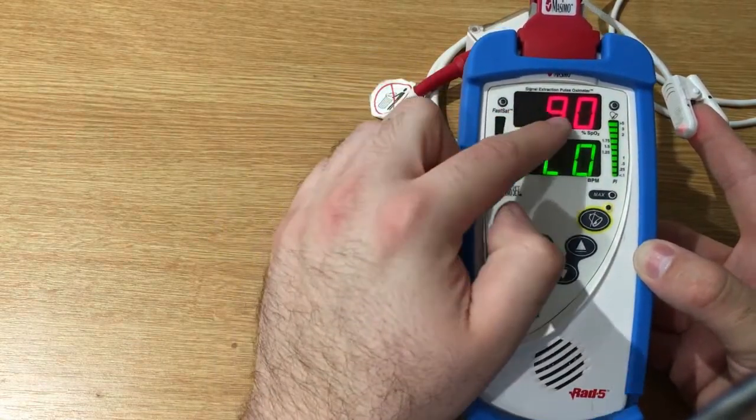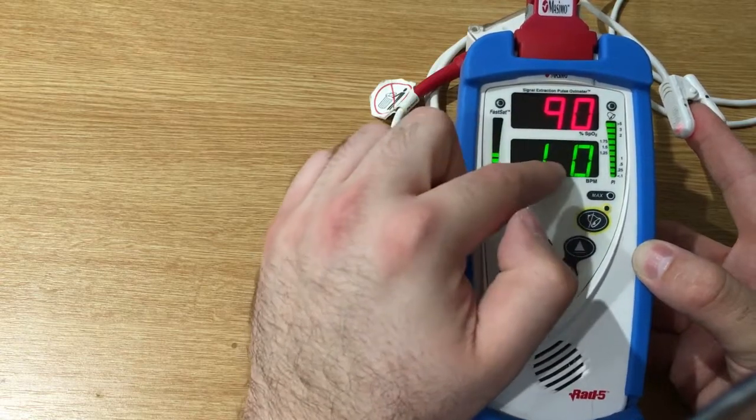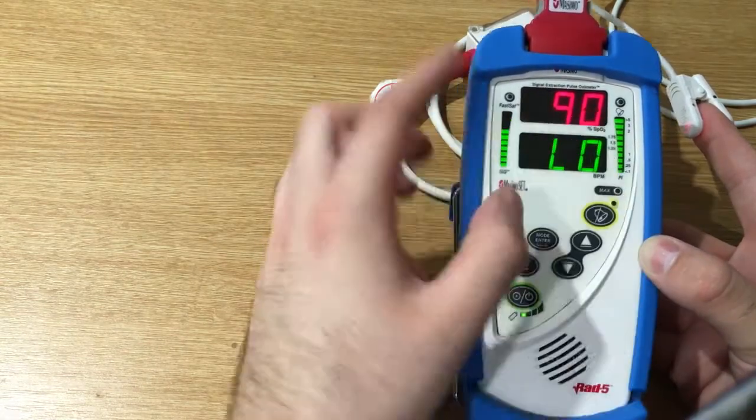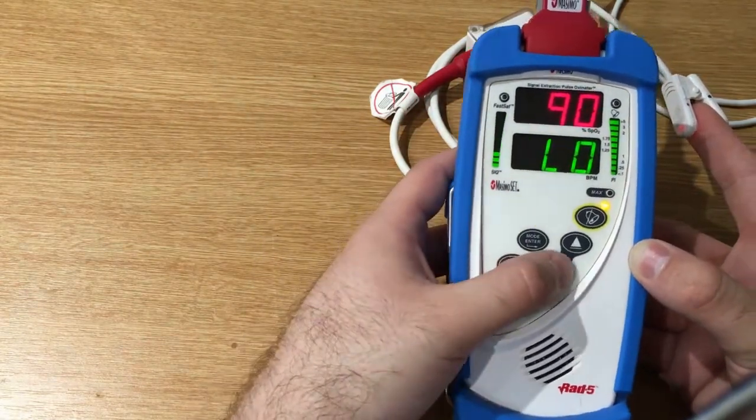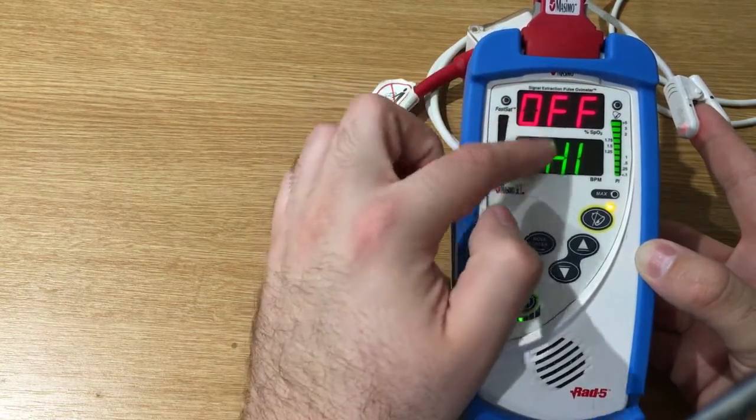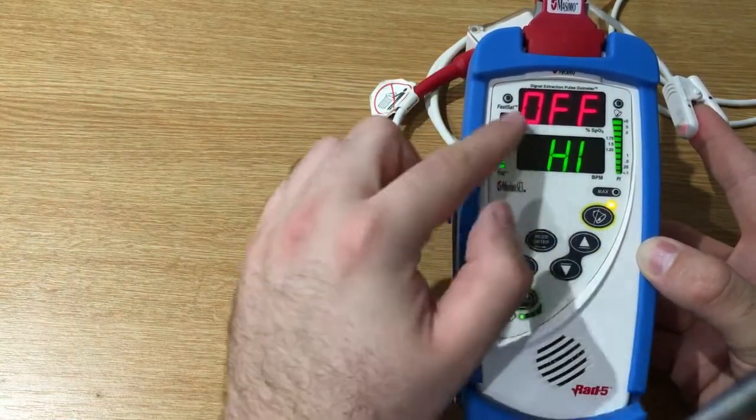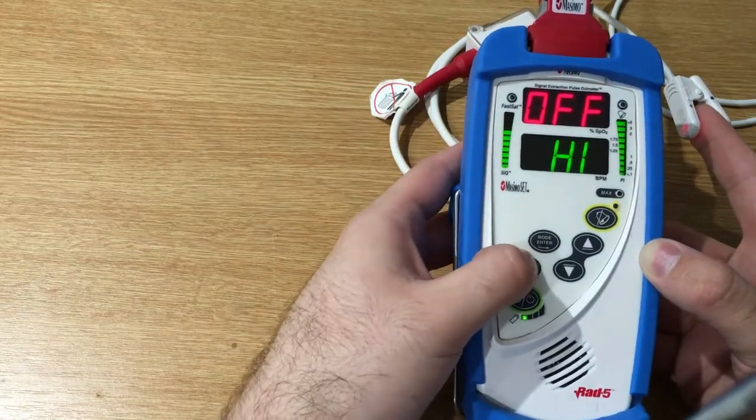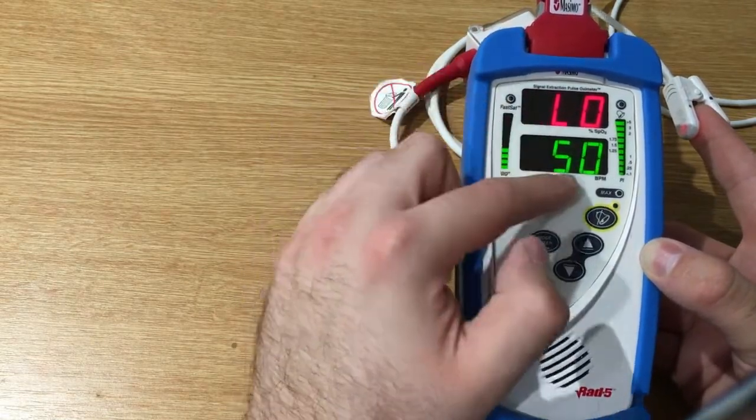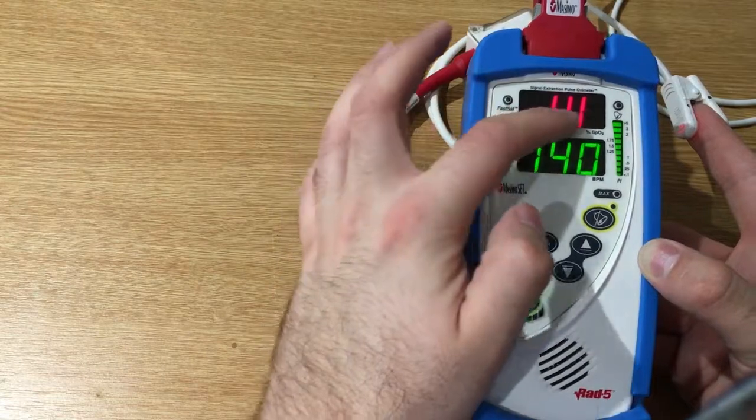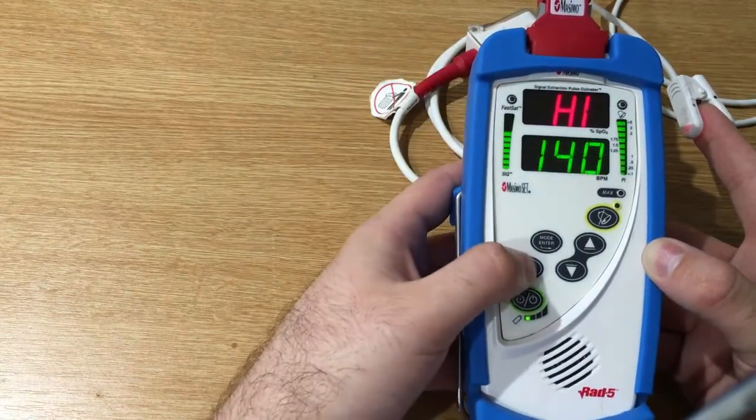So here we can set the alarm for low SP02, here for high SP02, here for low heart rate, and here for high heart rate.